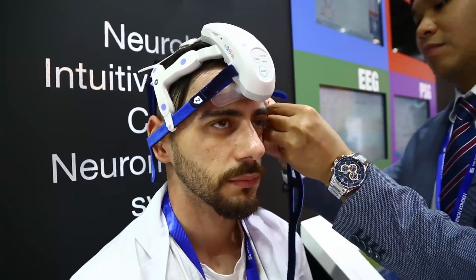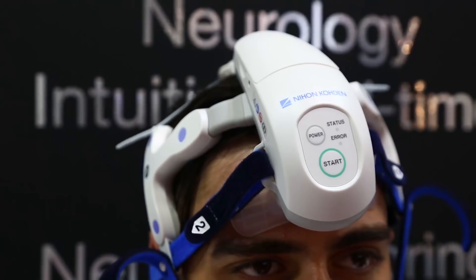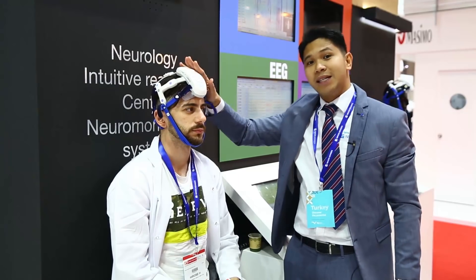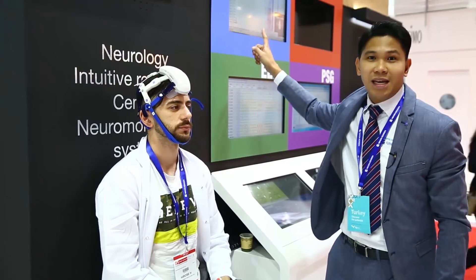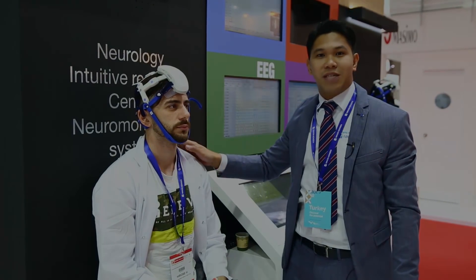By doing so, we can easily start the recording of the EEG. And the important thing is this is a wireless EEG, which means it is communicating with our EEG machine wirelessly — so no cables included on this machine.